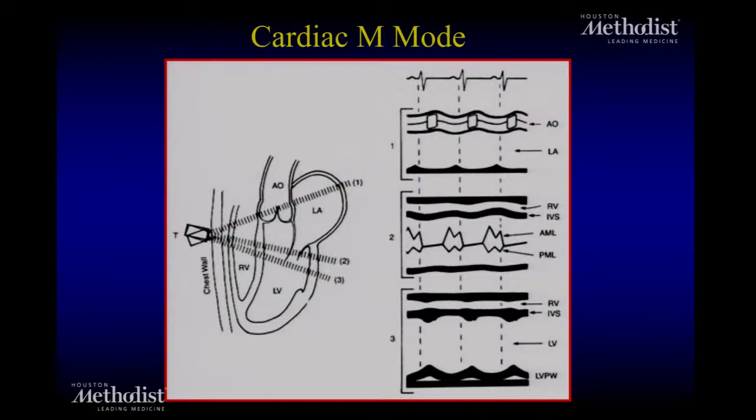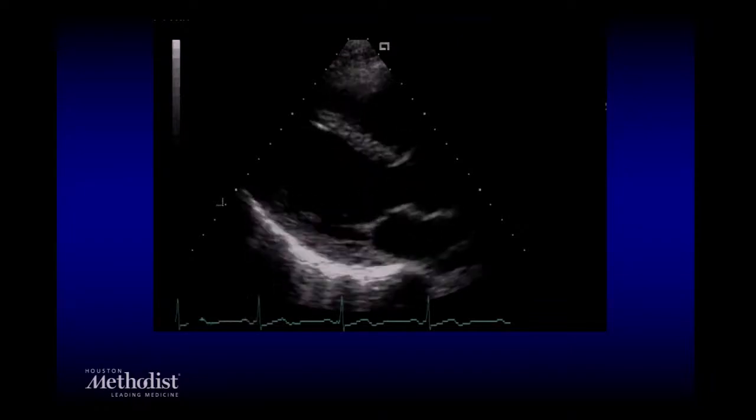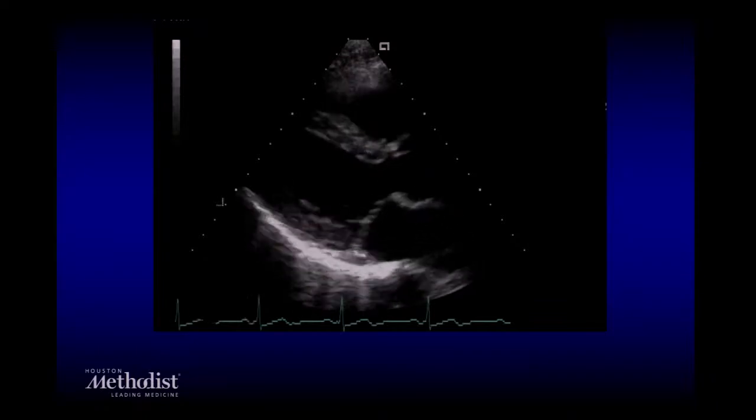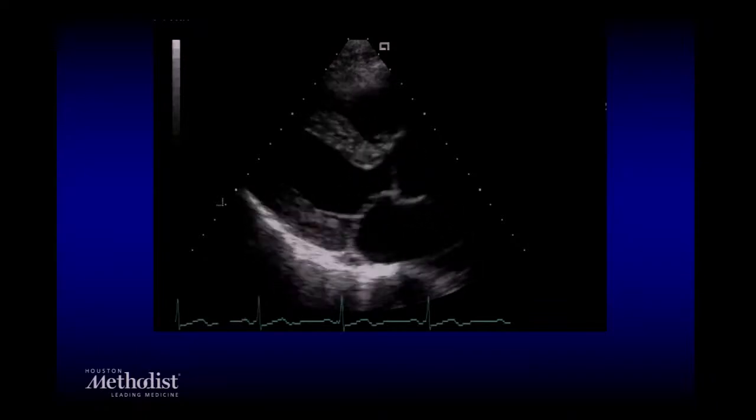In the early days, you had to be, as a sonographer and expert, doing your sweep of an M mode, et cetera, much more reliance on it. And nowadays, we have 2D and 3D. It's much less important for us to be able to do that. How do we construct a 2D image? Well, remember, 2D is a B mode, a brightness, right?